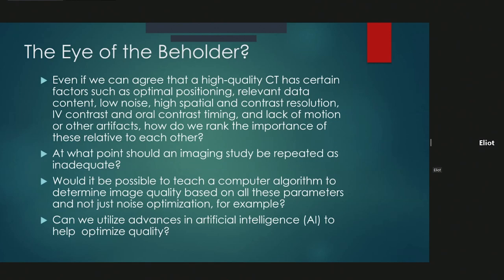And there's certainly the question about whether or not there would be value in being able to assess an examination and do some sort of repeat of some portion of the study as soon as the study is completed. But of course, that creates challenges with regard to intravenous contrast administration and dose.